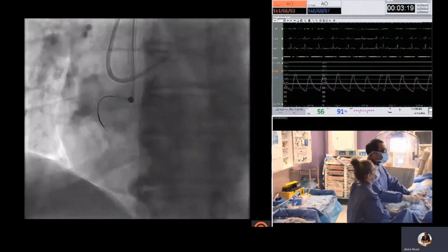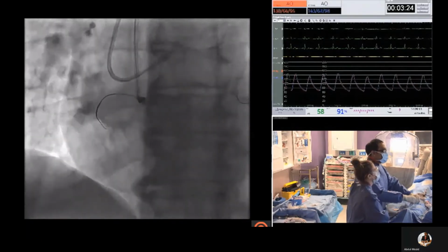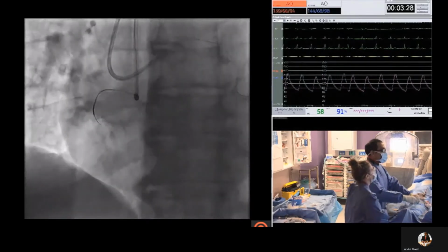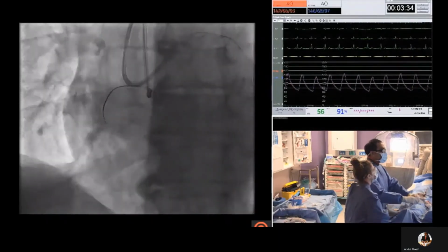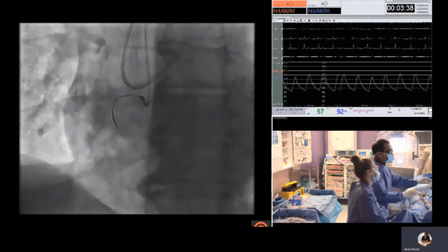We appreciate here again. Okay, so unable to cross with the Pilot 200.